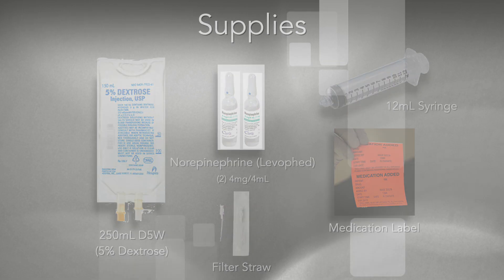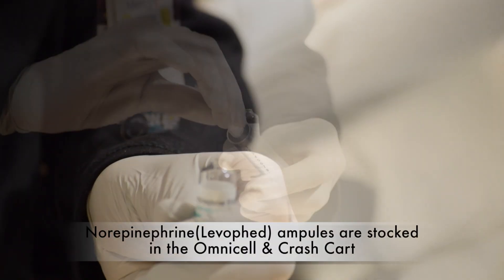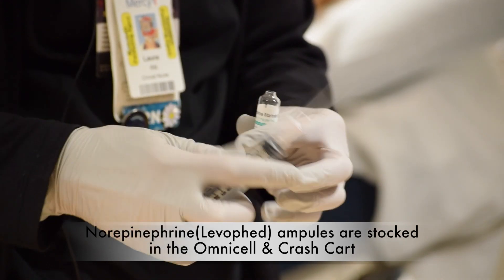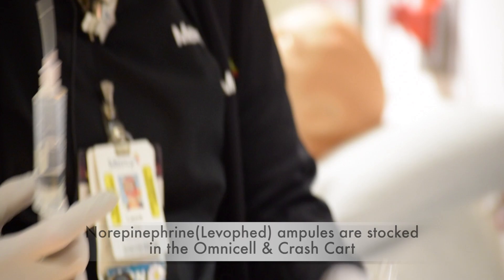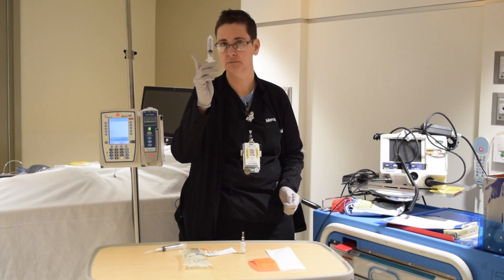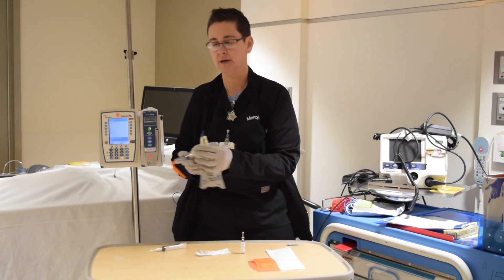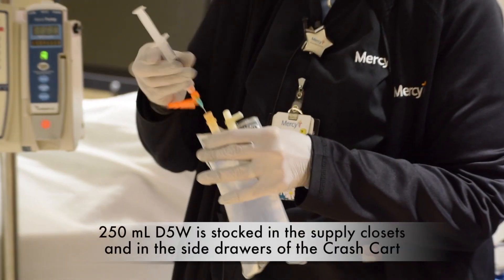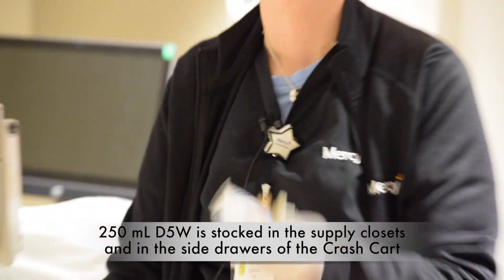The first thing you do is pop two vials of Levophed and use your filter straw to draw them up, since you are actually breaking the glass. In the end you are going to have eight mils of Levophed. You're then going to inject it into your 250ml bag of D5W and mix it up.